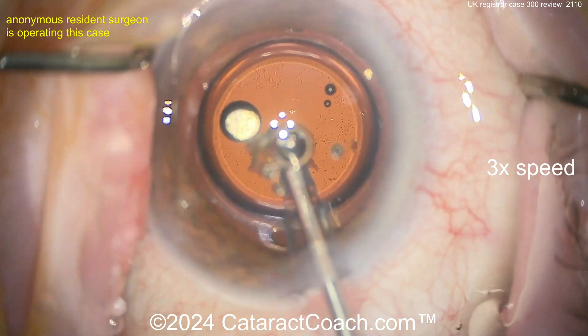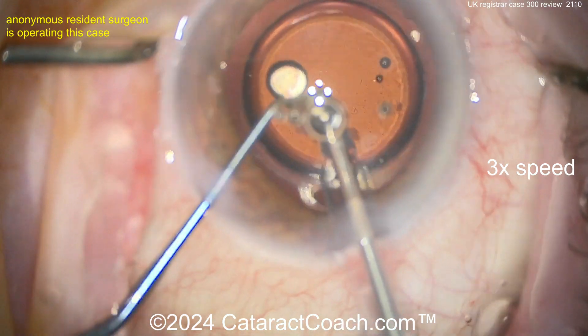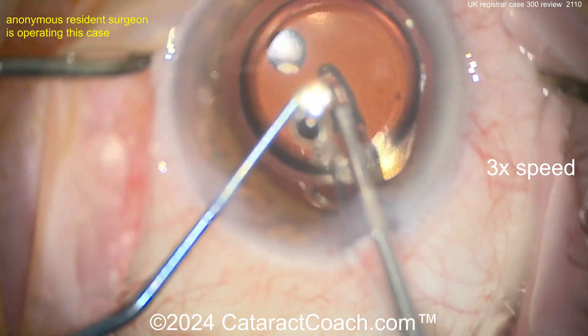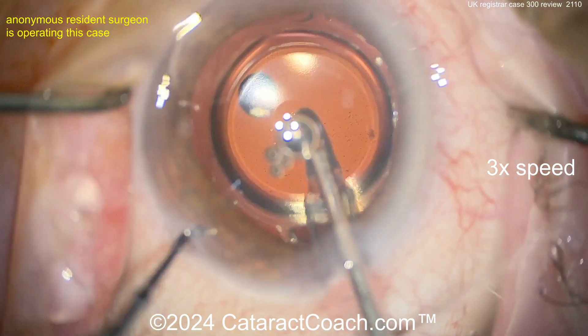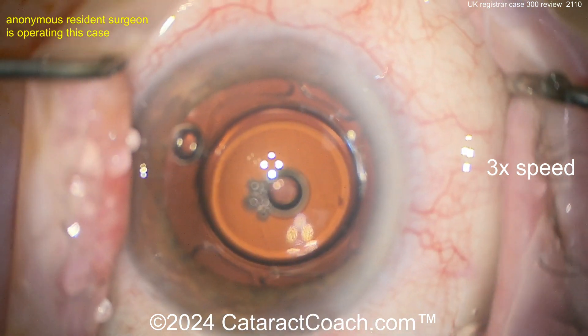My big suggestion for you is to move toward phaco chop — either horizontal chop, quick chop, vertical chop, combo chop, some kind of chop technique. Your stop and chop here is very nicely done, so no issues there, and I think you're doing beautifully.